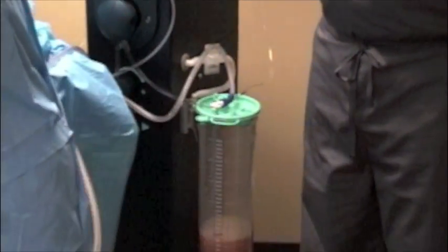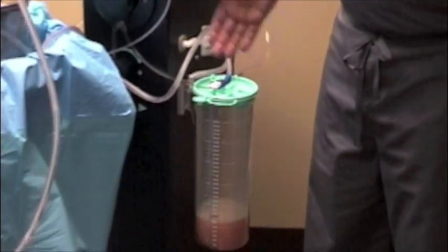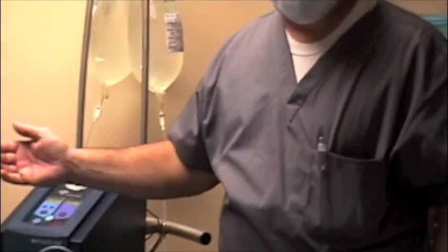There's a mesh filter in the lipo collector that prevents the fat from being evacuated into the suction canal. That fat is going to be collected and used for immediate re-injection.